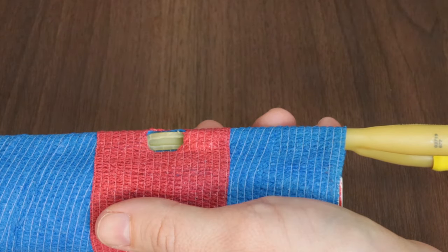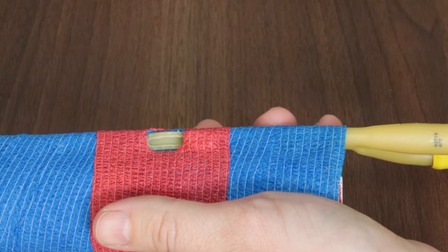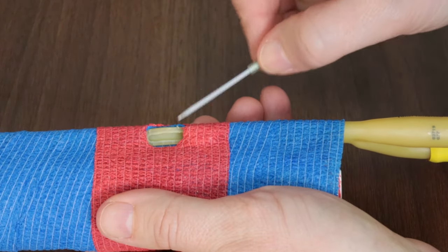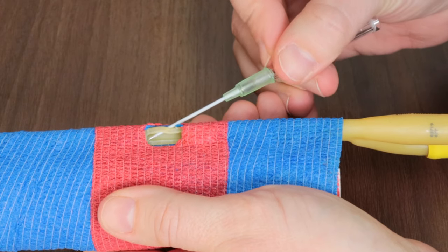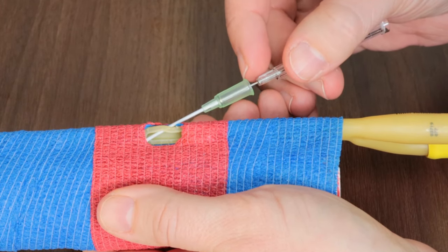So the third thing that I want to talk about is the catheter that didn't advance appropriately and where we go from here. So let's go ahead and get our catheter placed in our dummy here. All right. So we're in the vein, and then if for some reason, let's say we went out the other side, we advance our catheter off of our stylet a little bit.